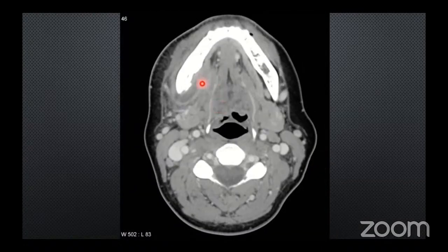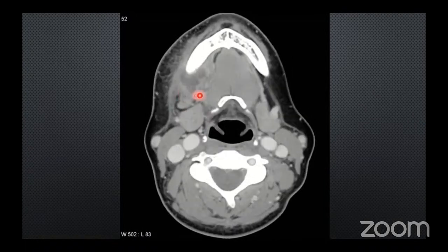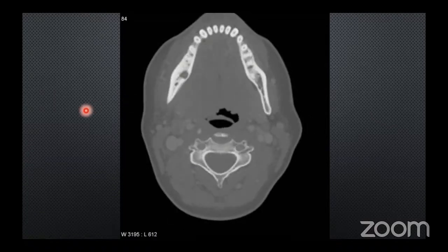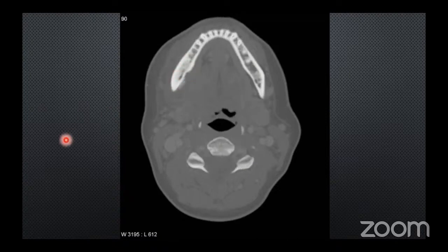You can see this better here on the axial imaging. This is the abscess involving the submandibular space. Bone window is very important because in the bone window you can actually see the cortical breach.